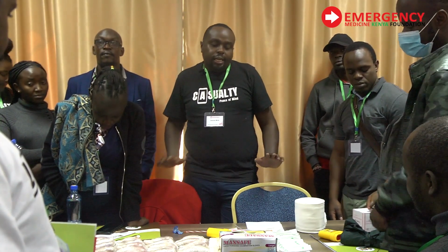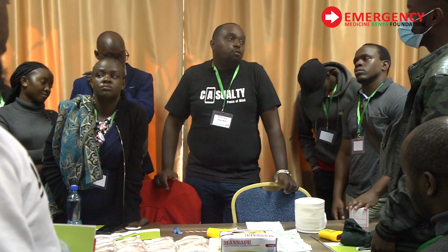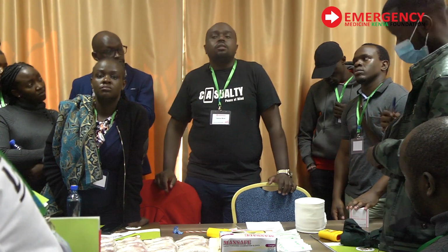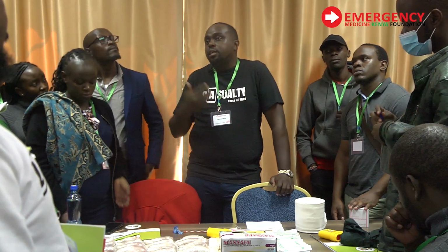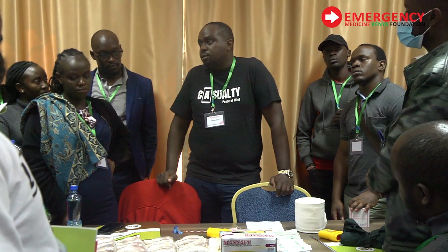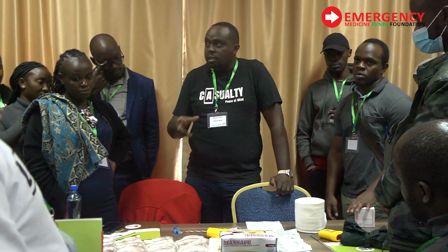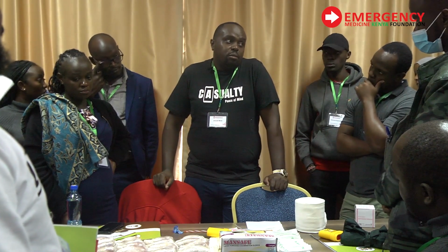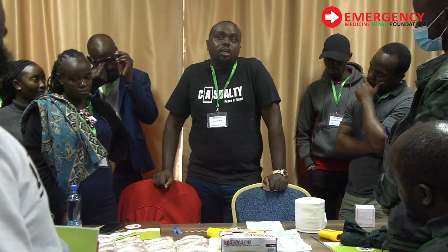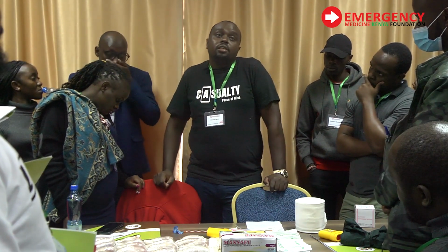Great. So the technique is the issue, and usually it is not a very difficult process. If you know the skill right and you have your equipment right, within 2 minutes at most, you would have gotten into the bone marrow and you'll be able to start resuscitation of the patient. 2 minutes at most, you would have saved lives. So now you need to prepare your equipment. Of course, you'll need a gauze to sterilize the area where you want to place. You need gloves. You'll need a needle suitable for intraosseous access. A needle suitable for intraosseous access should ideally be a big bone needle that is a bit strong. Sometimes we get this needle and we throw it away.